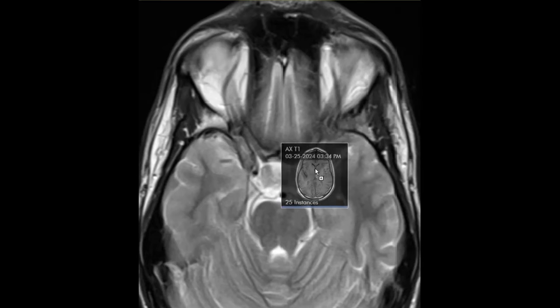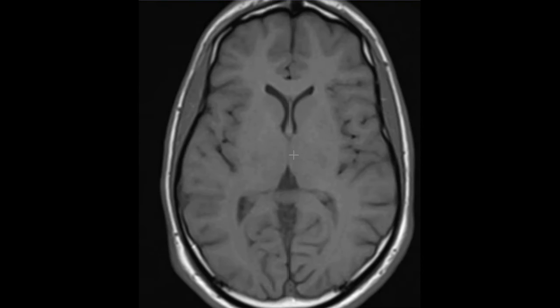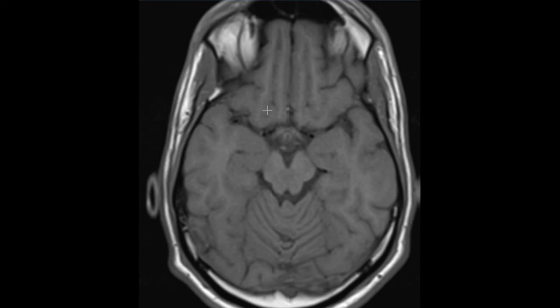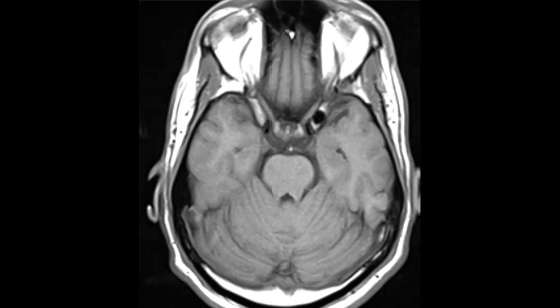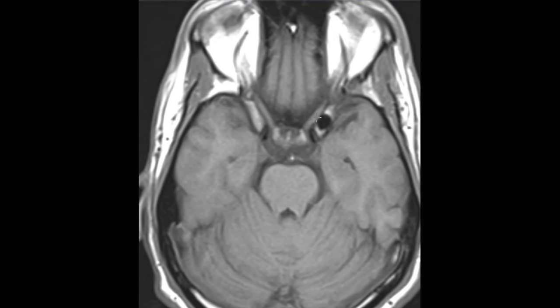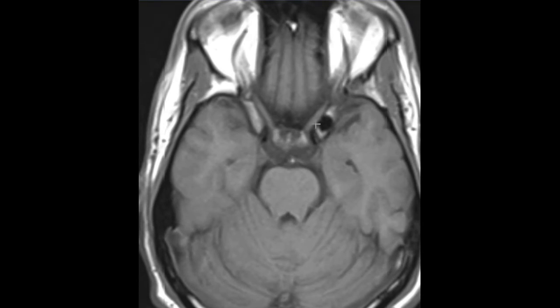We're going to put up a T1-weighted view to troubleshoot. On this view, we see the optic nerve coming along here, and the lateral wall of the optic canal is the clinoid process — a piece of bone, part of the sphenoid bone. So the anterior clinoid process is here.